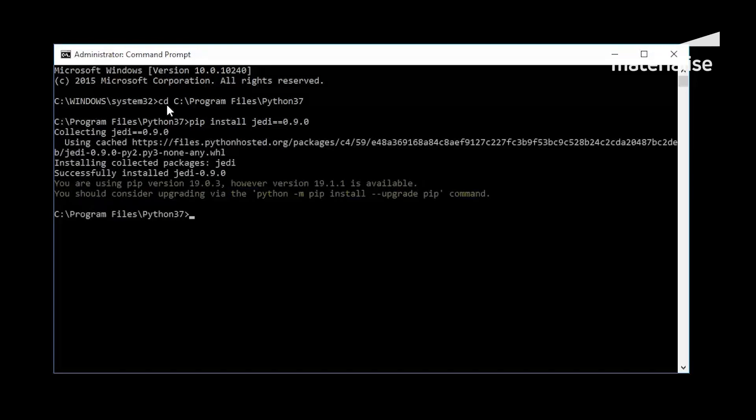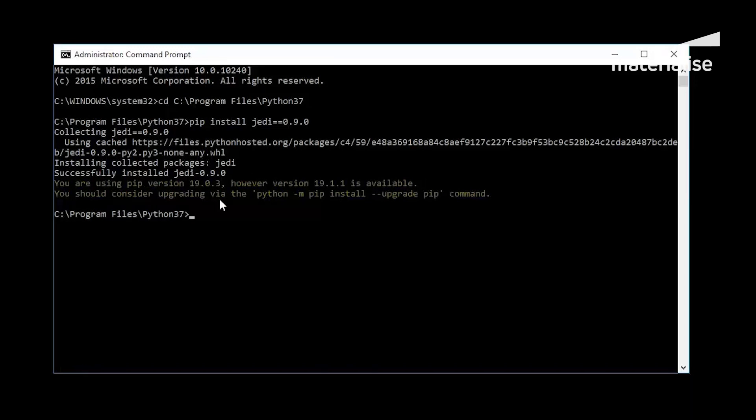With the successful installation of the JEDI package, you are now able to use the autocomplete functionality within 3-matic. Now, you will install the RPYC package by typing the following command as seen on the screen.